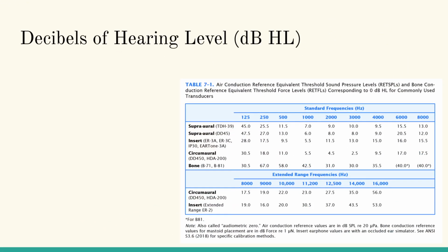Here are the conversion factors. The conversion factors are called RETSPLs and RETFLs. RETSPLs are reference equivalent threshold sound pressure levels, which are used for air conduction transducers. And then RETFLs are reference equivalent threshold force levels, which are used for bone conduction transducers.